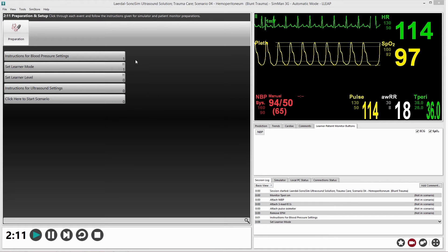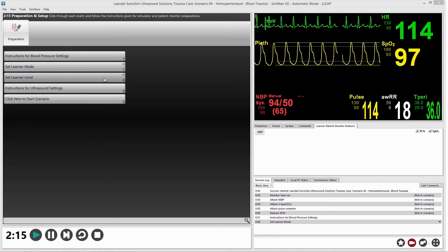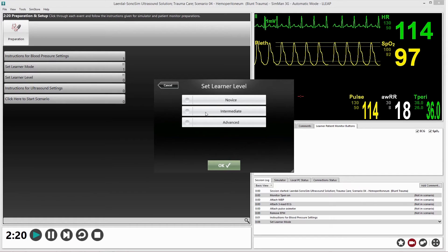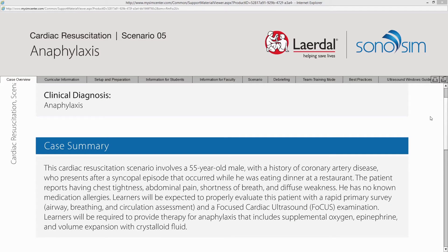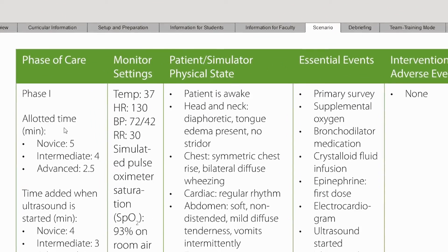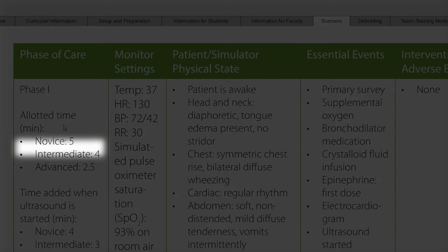To accommodate learners with varying levels of medical training and ultrasound experience, the Lairdahl Sonosim Ultrasound Solution scenarios have novice, intermediate, or advanced learner levels. While the medical and ultrasound elements of a scenario remain the same in each, the amount of time permitted to progress through a scenario depends on the learner level. Novice learners are given the most time, while advanced learners the least.